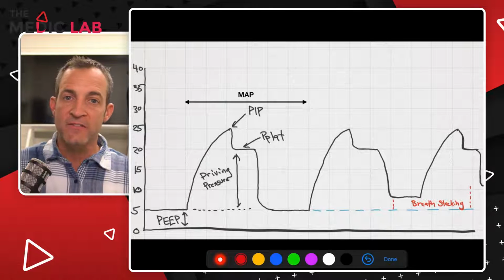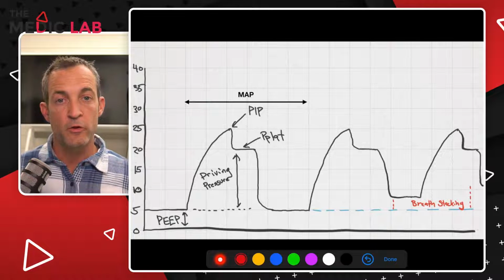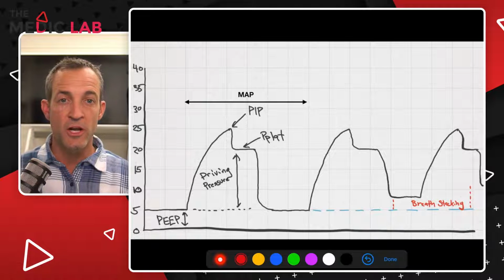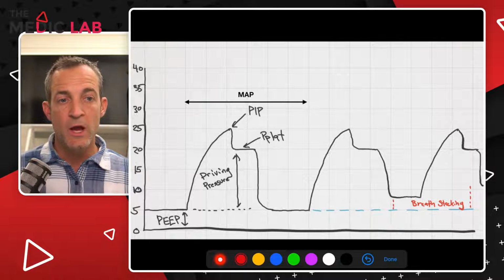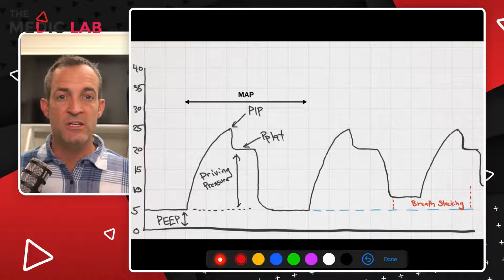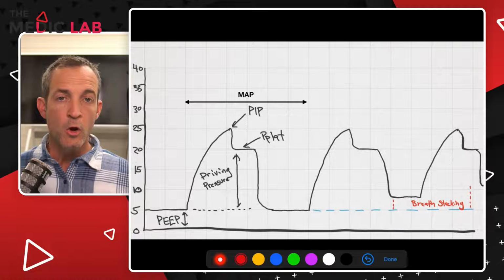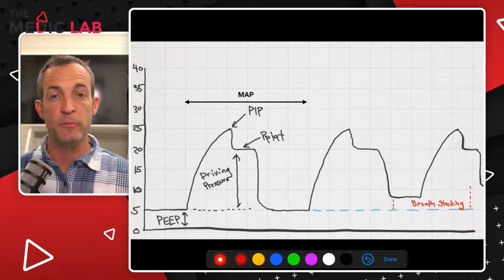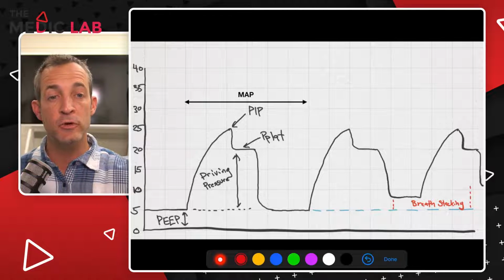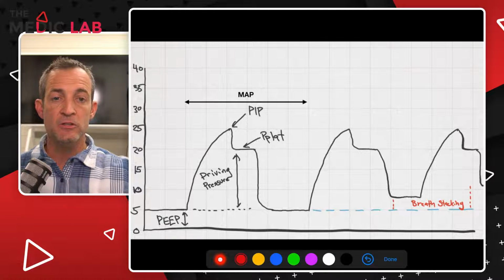And so they kind of stick together, and as the ventilator delivers the next breath, those alveoli are kind of popped open. The surface area of the alveolar tissue tends to stick together. It can cause a lot of tearing forces. It can cause a lot of inflammation. And so this positive end expiratory pressure keeps those alveoli open. There's other reasons why we deliver PEEP, and there's other reasons why we increase the amount of PEEP, primarily to improve oxygenation. But here's the thing.